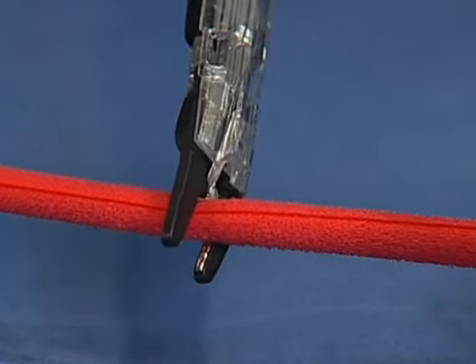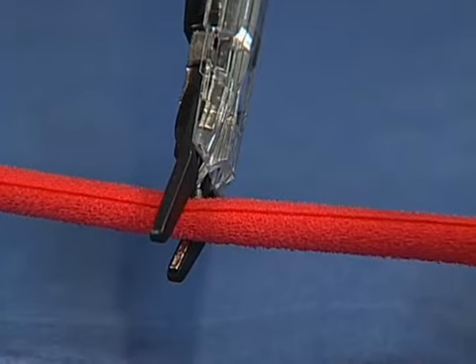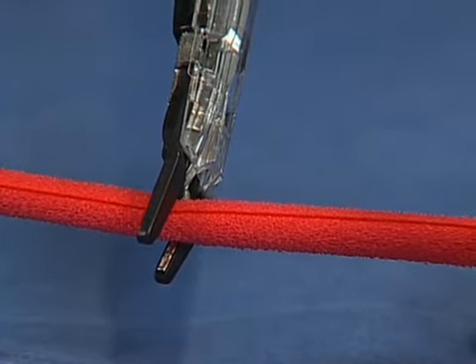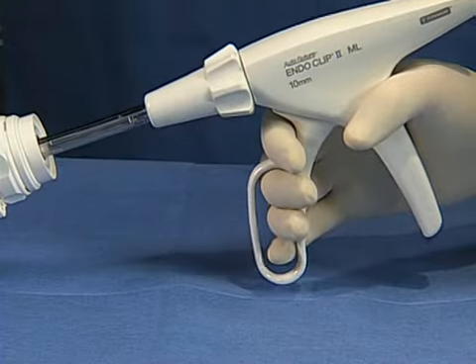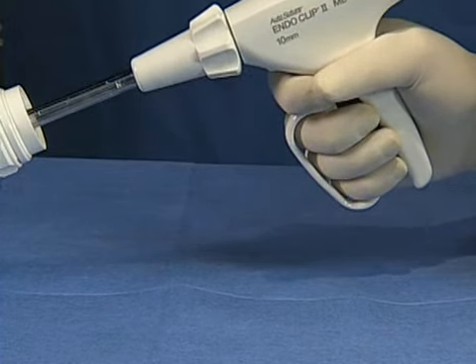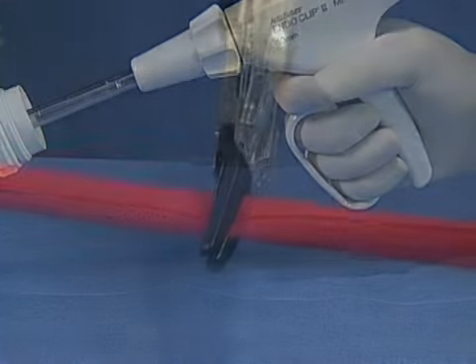Make certain that the tissue fits completely within the confines of the jaw. Do not torque or twist the device, as this may cause the clip to dislodge or malform, or may damage the vessel. Squeeze the handle firmly as far as it will go to fully form the clip. Note that partially squeezing the handle may result in clip malformation and possible bleeding or leakage.